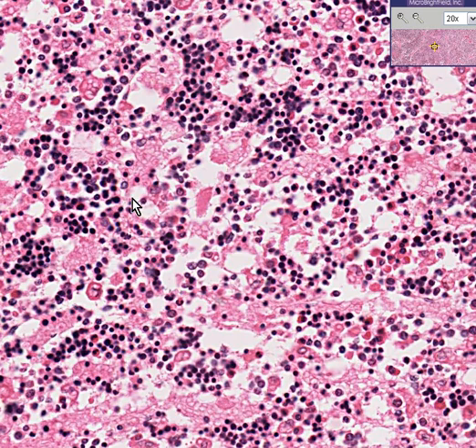It's certainly more common than the myeloid cells. So those are just the two things I want to emphasize, and we don't have to go into anything fancy right now. Hypercellularity and erythroid hyperplasia. That's why this slide is called bone marrow erythroid hyperplasia, and thank you very much.